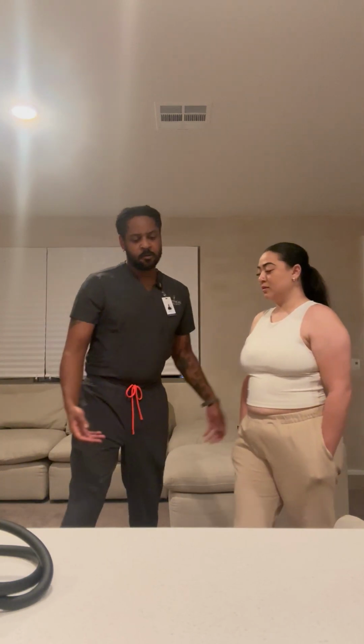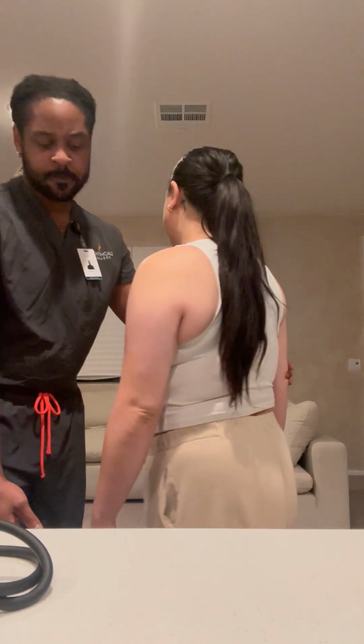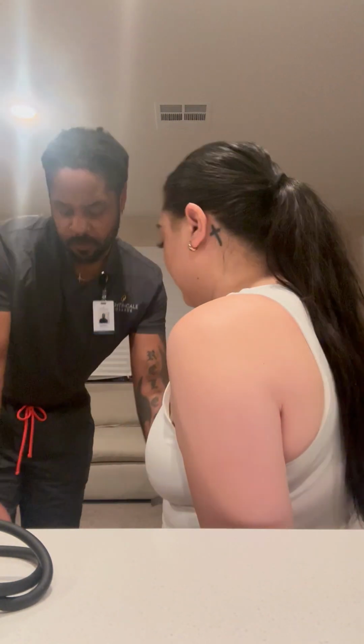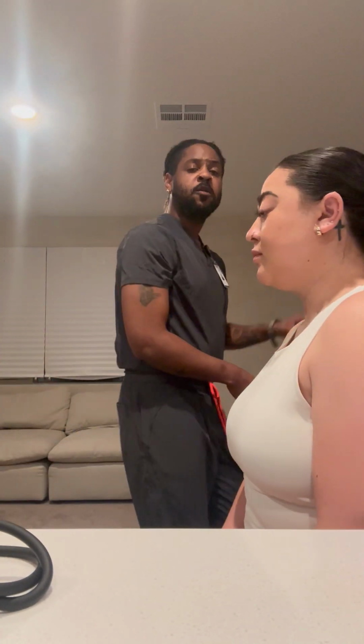Now, today I'm going to be performing a set of vitals on you. Are you okay with that? Yes. Okay. Would you mind coming over here? I'll bring a chair closer for you. Would you mind taking a seat, and making sure that your feet are flat on the ground, not hanging? Okay. Now I'm going to close the blinds for her privacy.